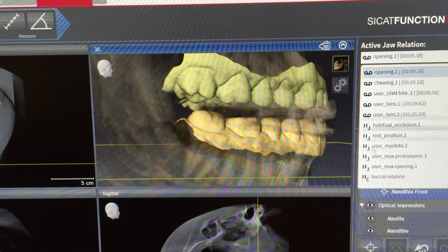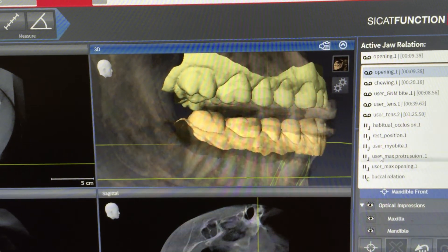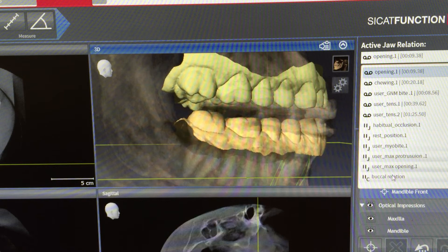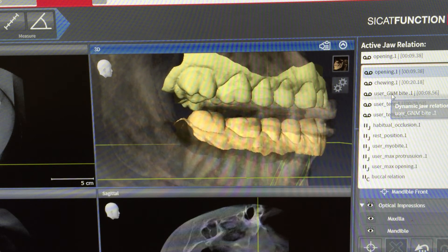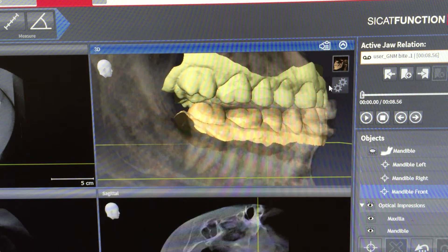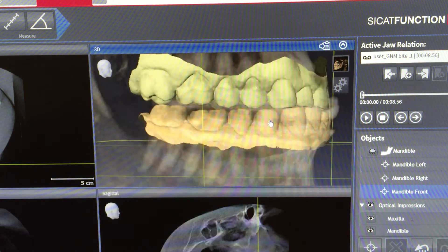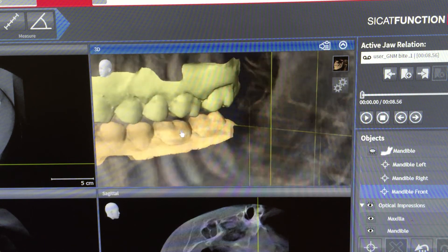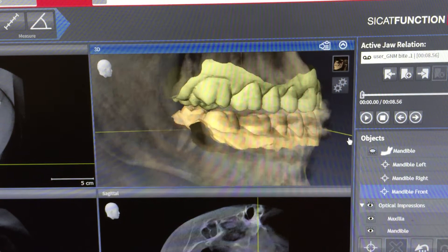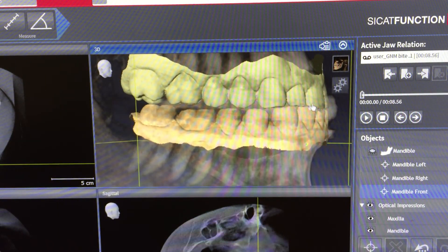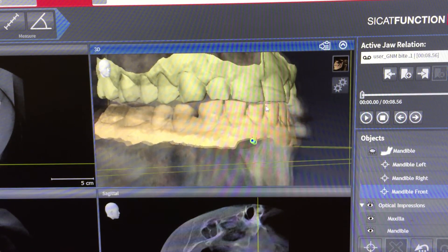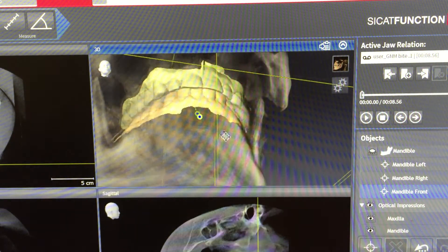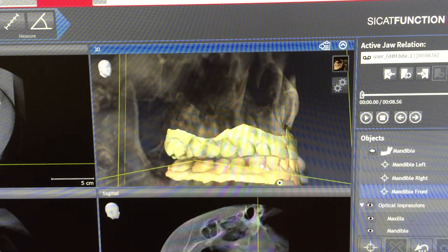I have my neuromuscular bite stored and I will confirm how accurate I am with the kinematics. I retrieve my neuromuscular bite and can see that I'm in the same trajectory of closure, with less vertical dimension of course, to be able to fabricate the less invasive orthotic. In the optimized bite position, the contact area is confirmed to match where the patient has all these wetting facets.